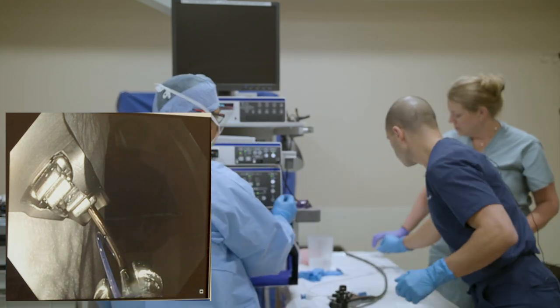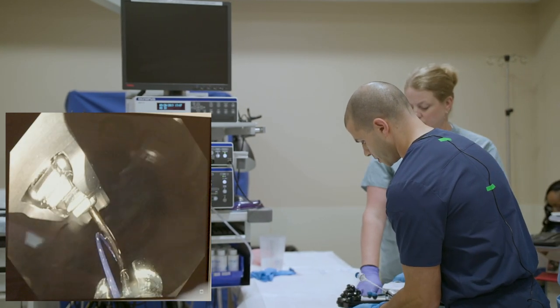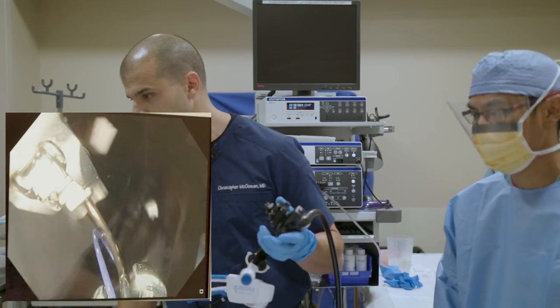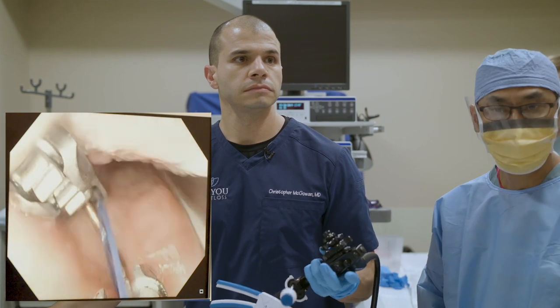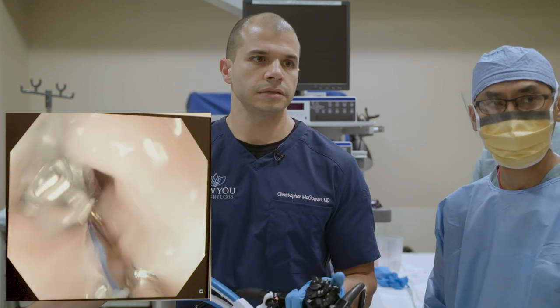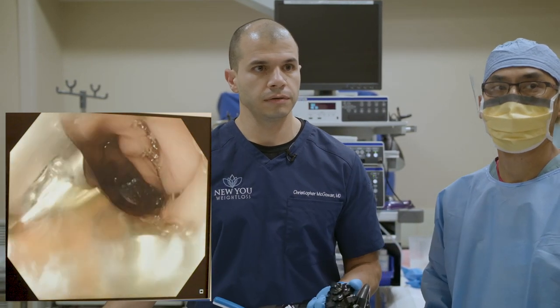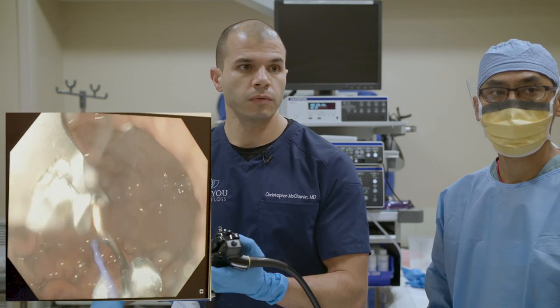We're switching to the dual channel scope now. It has two working channels to pass instruments through. On the tip is the overstitch suturing device, which allows us to suture from inside the stomach. The suture is visible in view — I'm squeezing the handle to pass and close the needle. This is a really novel technique; the ability to suture from entering through the mouth is quite an innovation, though it was a steep learning curve and is technically complex.